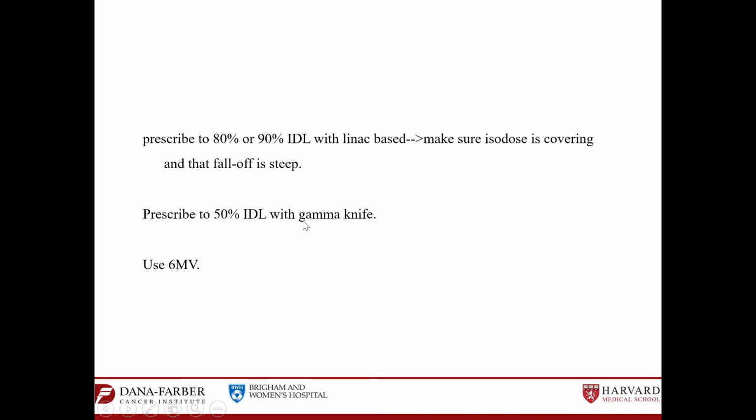And for sure, if you cannot meet this, if you feel like your cone beam CT is really a mess and the ExacTrac cannot catch the maximum points you are heading to, you can say maybe we need the therapist to first position the head of the patient in certain ways. But if that's not helpful, maybe you need to do a resimulation and replan, right? Because you cannot treat with a deviated cone beam.